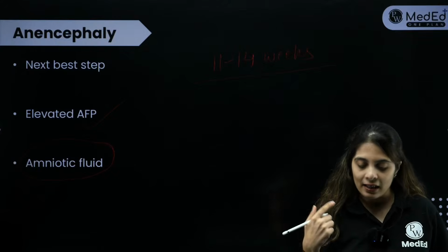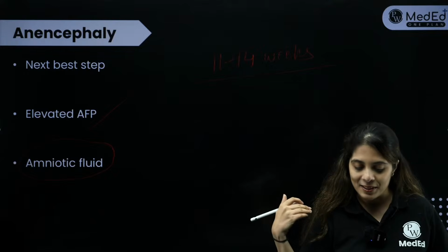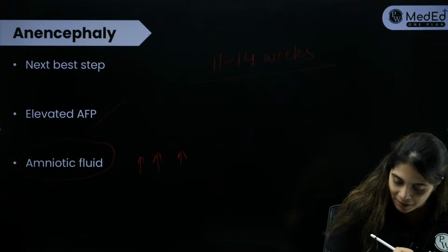Actually, there is a lag. When I ask the question, there is usually a lag of 1 minute, and that is why I move ahead and then the answers come later on. So the amniotic fluid will increase. When it comes to anencephaly, there is always polyhydramnios.